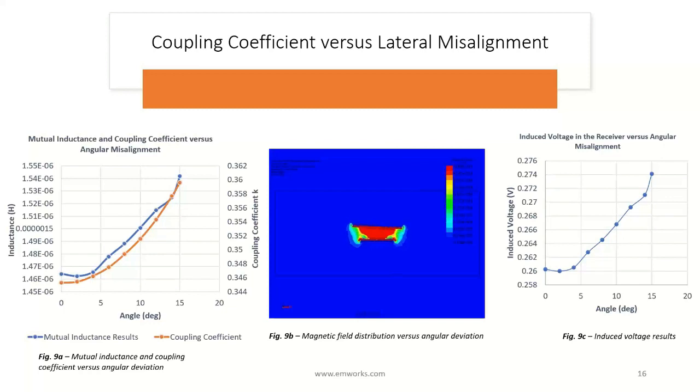Now we are going to see the impact of the angular deviation between both transmitter and receiver coils. Angular deviation means that the facing planes of the primary and secondary coils are no longer parallel. A small increase of the mutual inductance and the coupling coefficient can be noticed from figure 9a. The magnetic field going from the transmitter to the receiver keeps the same or maybe higher values for the simulated configuration. This can be confirmed from figure 9b. No big variation in the magnetic field of the receiver. The induced voltage reflects this behavior by going a few steps up.